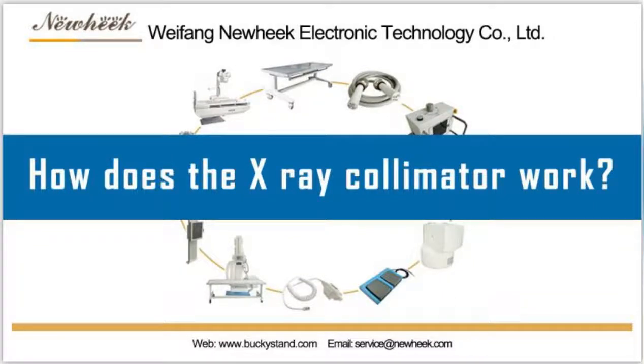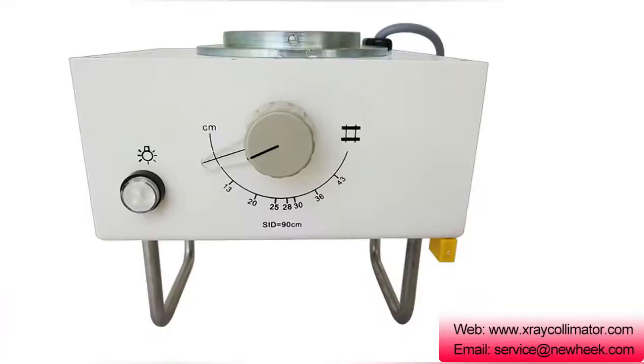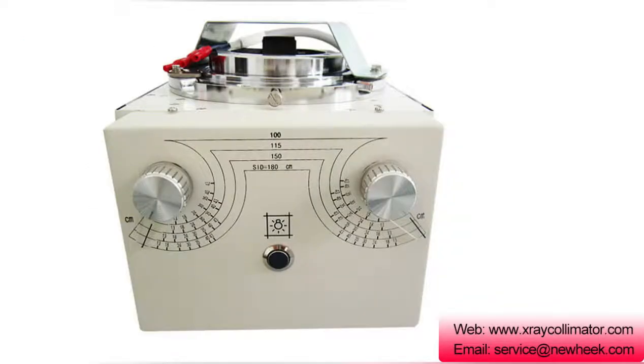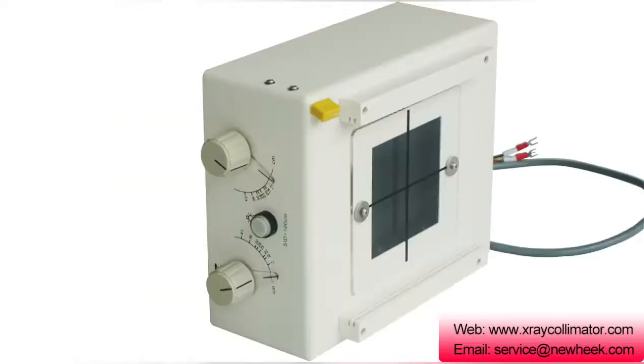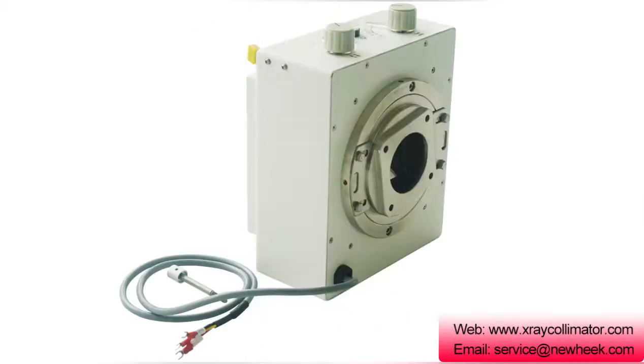The X-ray collimator is a beam direction device used in an X-ray tube housing, as well as a mirror and light arrangement such that the light and X-ray fields match each other. They are made of lead shutters that completely absorb photons, thereby reducing patient dose and focusing the radiation to the area of interest accordingly.